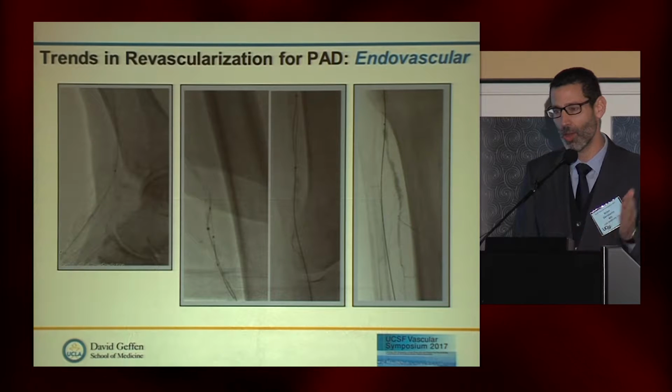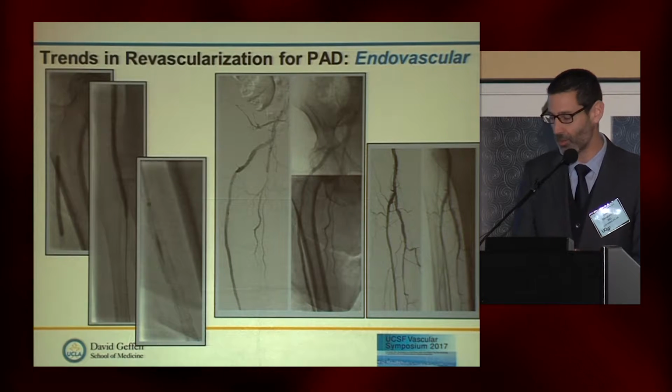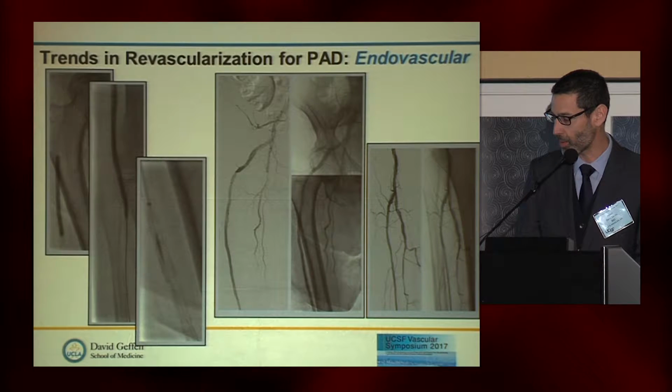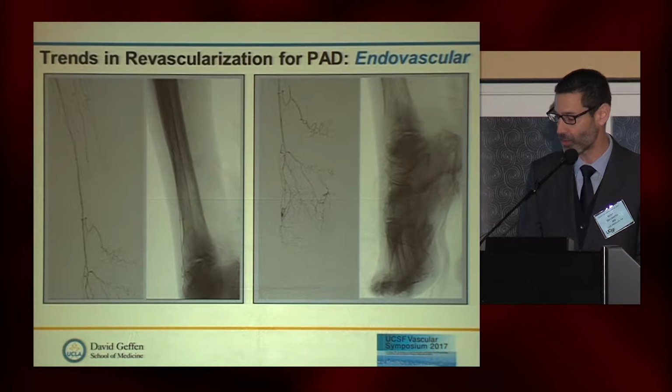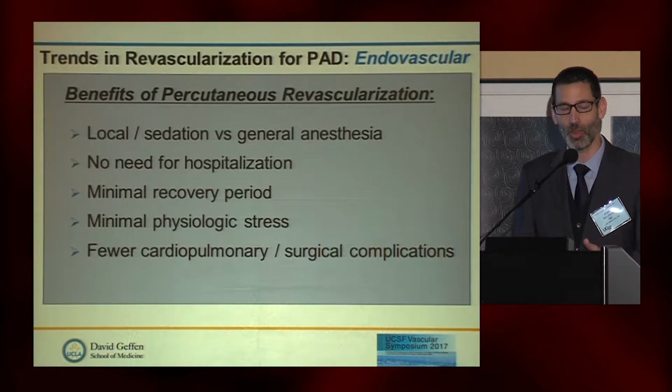So we couldn't cross antegrade. This is a case where we had to use retrograde access by puncturing the DP and coming up from below. This allowed us to establish through and through wire access from the groin all the way down into the anterior tibial artery. This was treated with balloon angioplasty and stenting with Supera because of the heavily calcified nature of this patient's disease. And you can see on the right the completion images, which shows inline flow all the way down to the AT and peroneal, which is actually a pretty good vessel as well, and flow all the way down to the foot to help her heal her wounds, and gave her a palpable pulse on at least the proximal aspect of the foot.